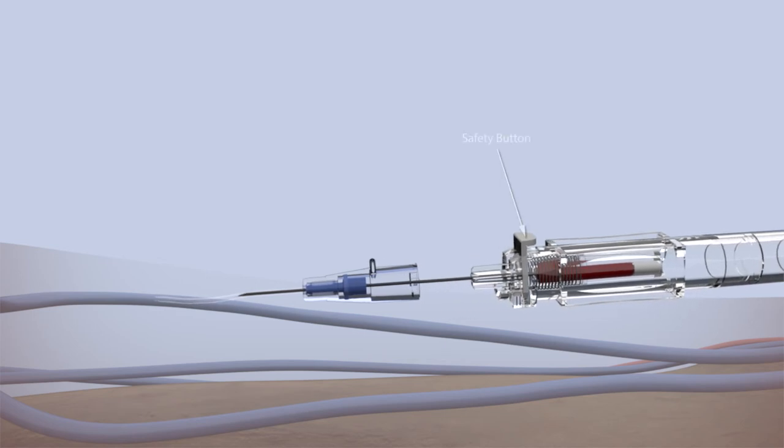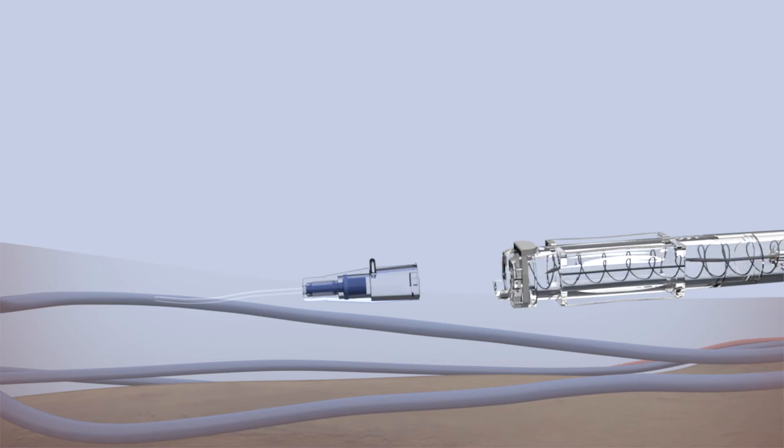Push the safety button, which is located on the top of the catheter's body. The active safety mechanism automatically retracts the needle inside the catheter chamber. An audible clicking sound indicates the needle is now safely sheathed and ready for disposal.